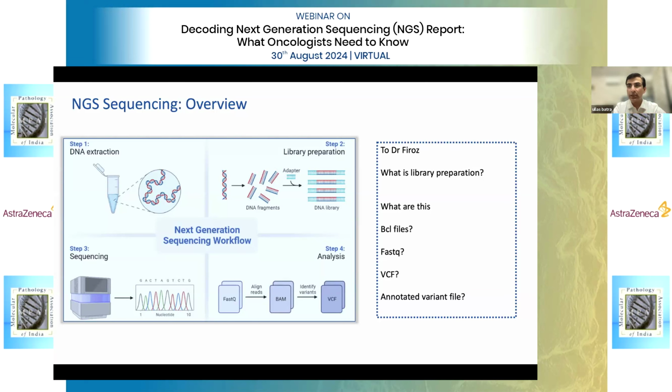So we have sent to the histopathologist. We have broken down the DNA, fragmented, then we are going to amplify. Then what happens? Roughly this will take around day 4 as per you. Let's go by the number of days. So DNA extraction and then quality check.